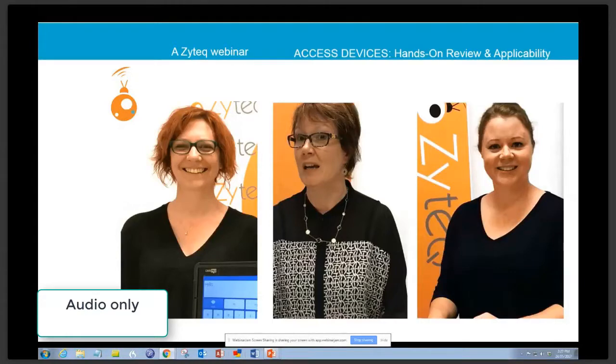So we're having our hands-on review of Zyteq's access devices today. We're covering all the devices, or many of the devices, that offer alternative access. In our previous webinars, we discussed how to evaluate access in relation to an individual who has difficulty with the standard keyboard or mouse or touch screen and so on. And here we're reviewing the available devices.